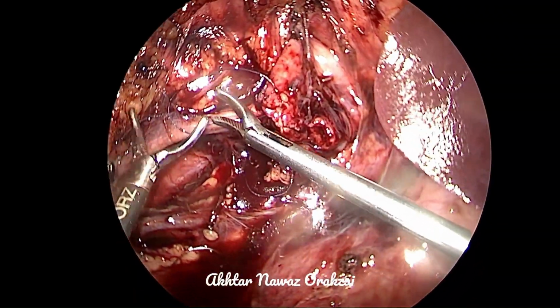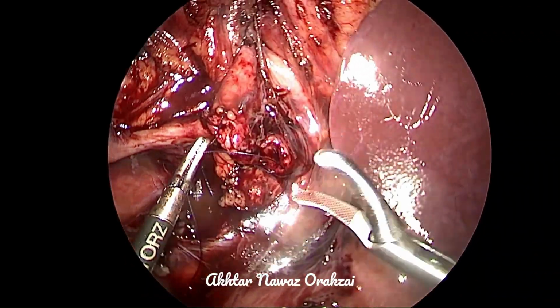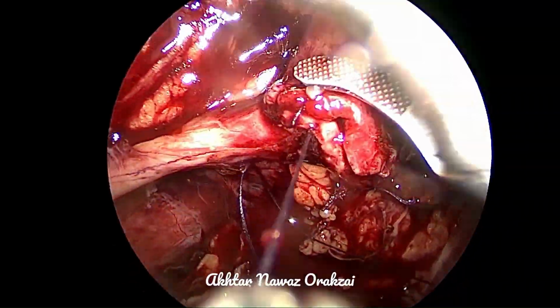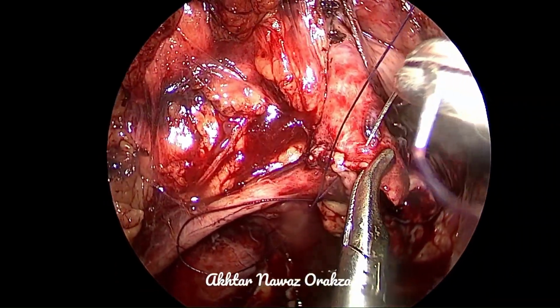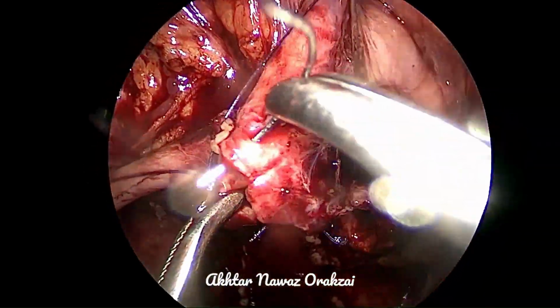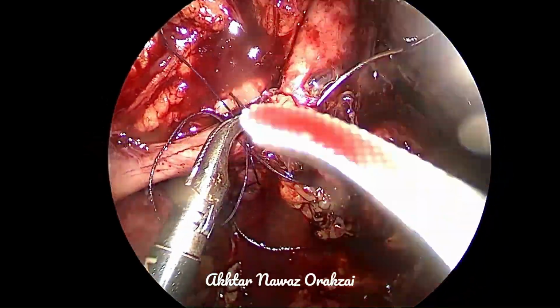So while performing pyeloplasty, especially laparoscopically, one must be mentally prepared to encounter a crossing vessel. And when it is encountered, principles have already been discussed. Dissect the ureter and the pelvis from the vessel rather than dissecting the vessel from the ureter or the pelvis, in which case there may be injury to the vessel, and the whole of the procedure will become a mess.